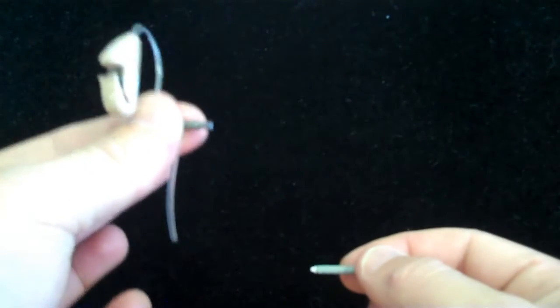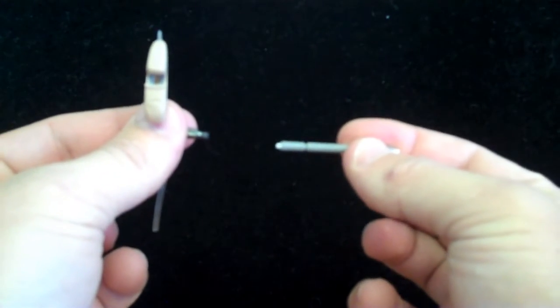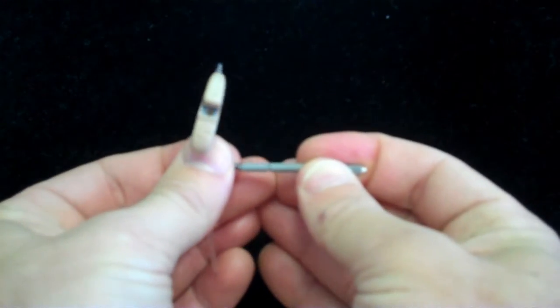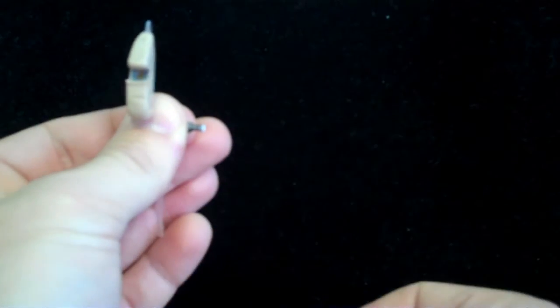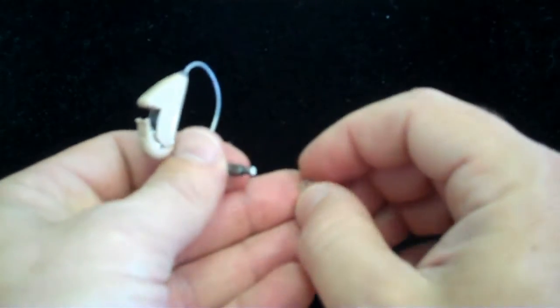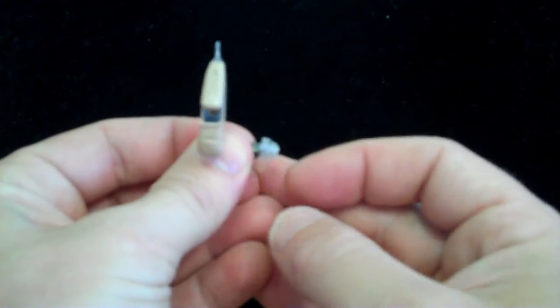So now we have no trap on the end here. We take the tool, turn it around, push the new trap directly into the hole, and remove. The wax trap stays in the receiver. We've just replaced the wax trap on this hearing aid. We can then slide the dome back on the tip just like so.